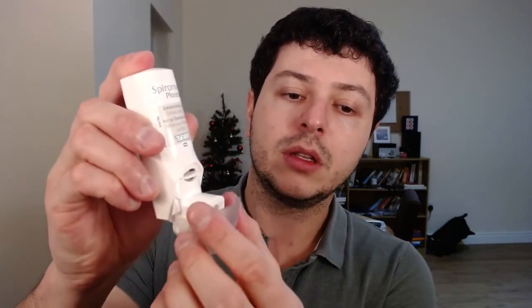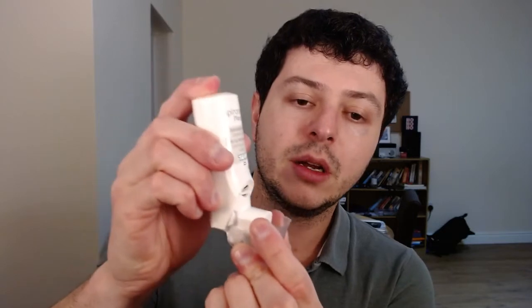Open this up — there's a little bit of resistance here but it will go 'clack' when it's activated. Now it's ready to use. Take the air out of your lungs first.